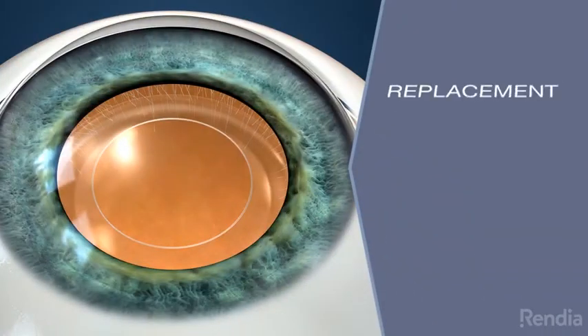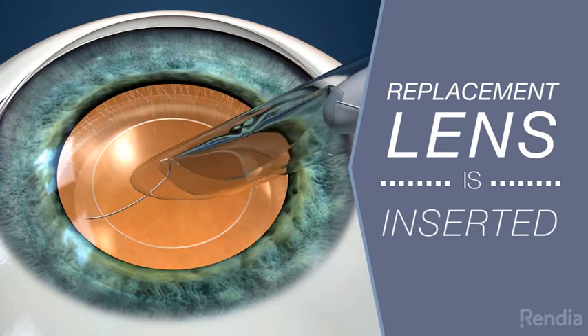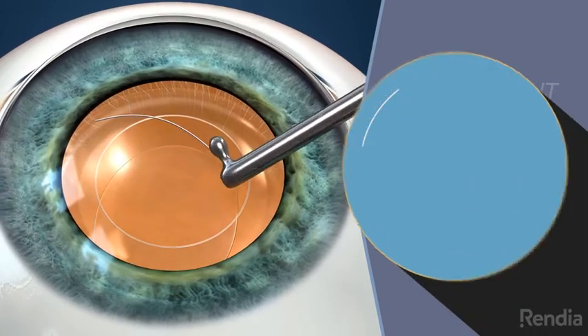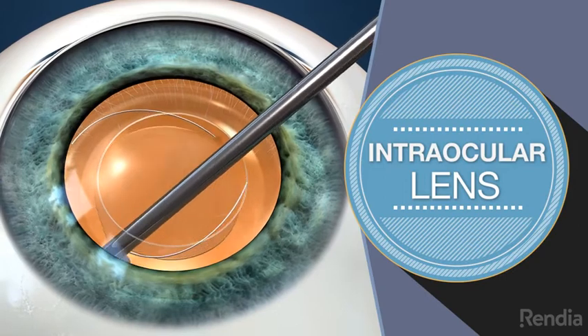Once the cataract has been removed, the replacement lens is then inserted into the capsular bag where the natural lens used to be. In most cases, this is an intraocular lens which is foldable and slips in through the tiny incision.